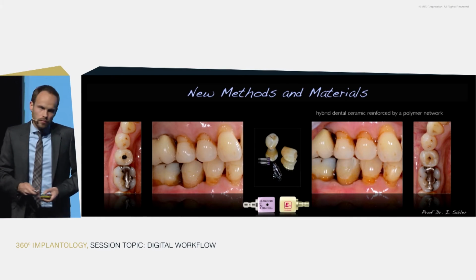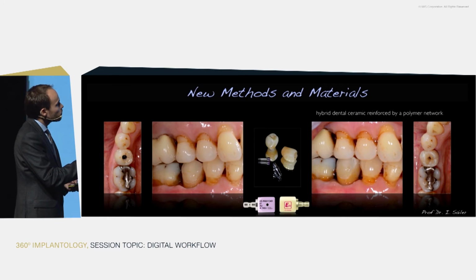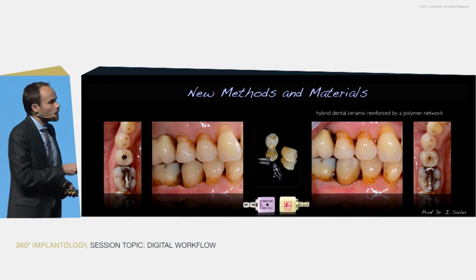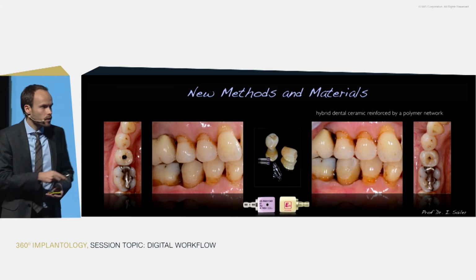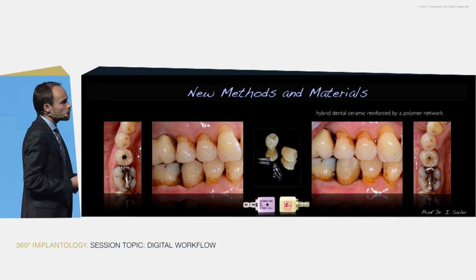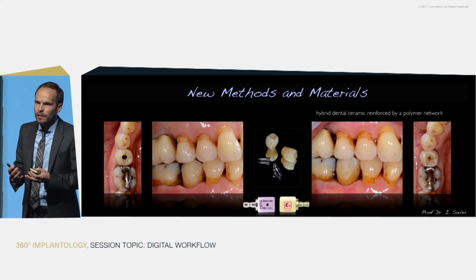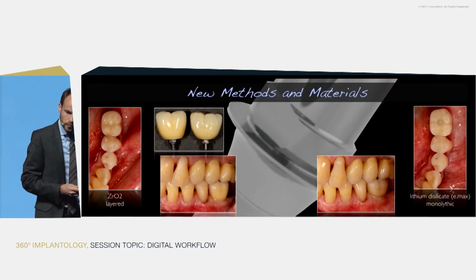More complex, not really complex, a single implant here, 2 different brands, just stained and glazed. One of them is a hybrid material, like a composite mixed with ceramic, and the other side, the lithium disilicate, the EMAX. Both of them absolutely clinically acceptable and beautiful due to the stain and glaze technique, but still it's a monolithic structure done and built for us by the industry.